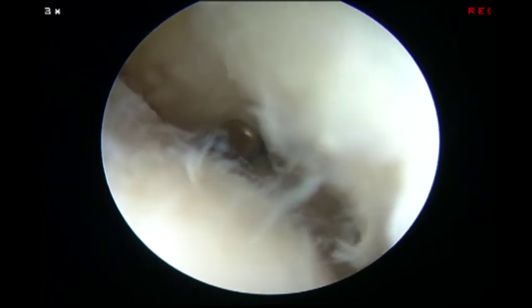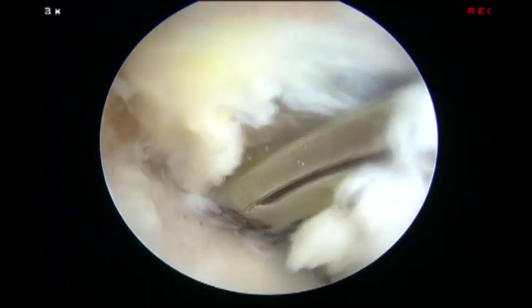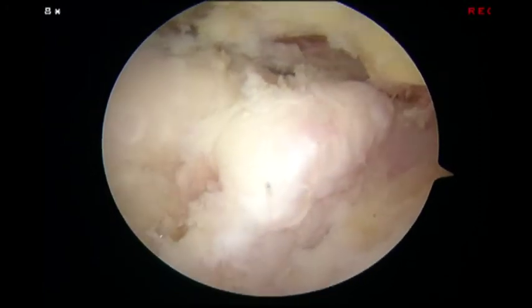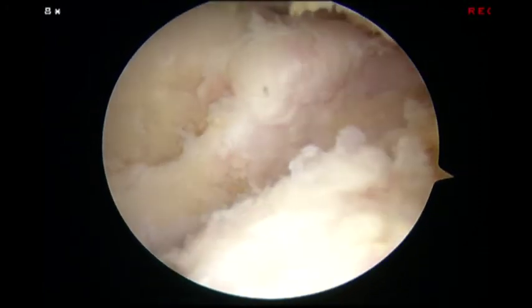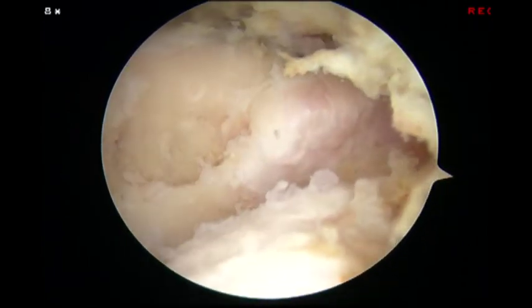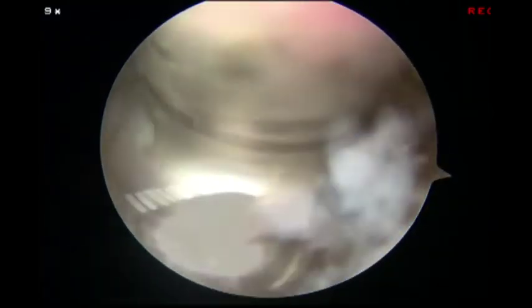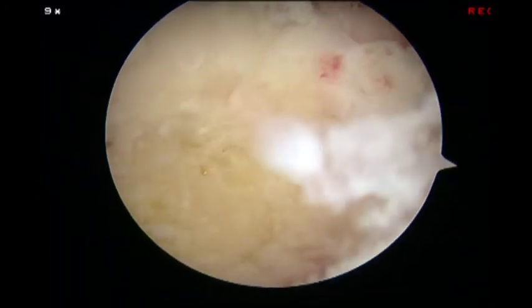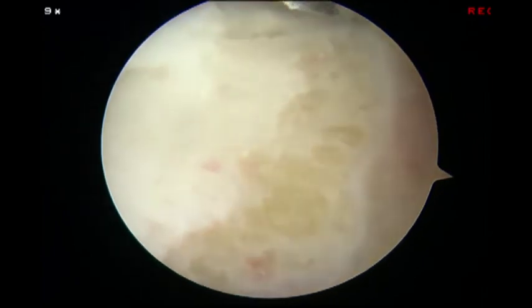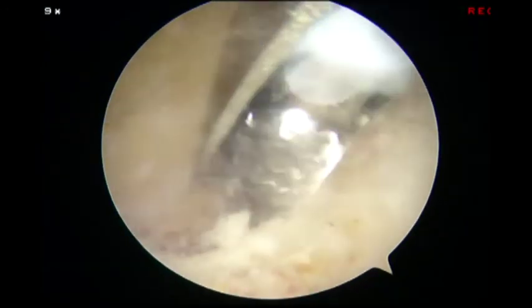An arthroscopic biter was used to perform an anterior capsular release from lateral to medial, or radial to ulnar. Next, an accessory posterolateral portal was utilized for visualization and a direct posterior portal was utilized as the working portal. Numerous osteophytes and multiple loose bodies filled the olecranon fossa. These were mobilized and subsequently removed with a combination of a burr, followed by an arthroscopic osteotome and occasionally a shaver. Final contouring of the olecranon fossa was done with a burr.